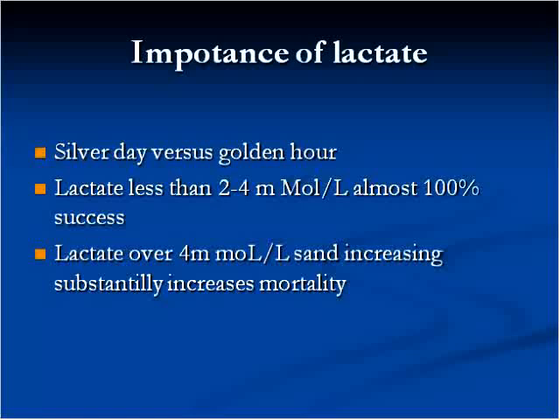I would say certainly less than 2 milliliters. Perhaps a lot of the machines can run less. Some of the machines, again, depending on the analytes that you're going to run, may need more. So it's really instrument dependent, and it's nice to have a little bit of extra in case something would go wrong. But I would again refer to whatever instrument you use. What are their recommendations? What's the minimum sample size? Because they have that information out there.